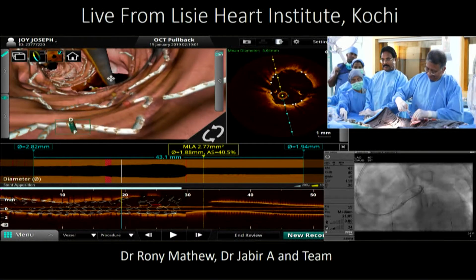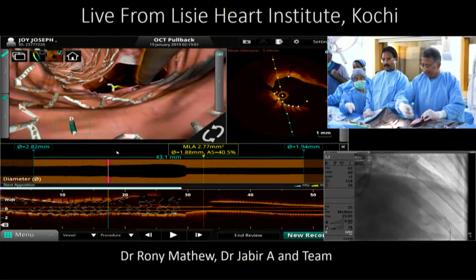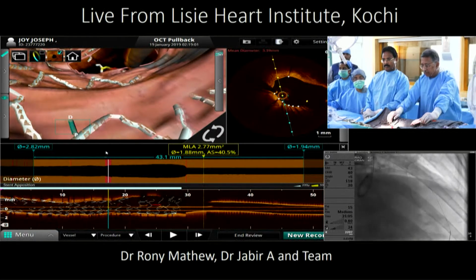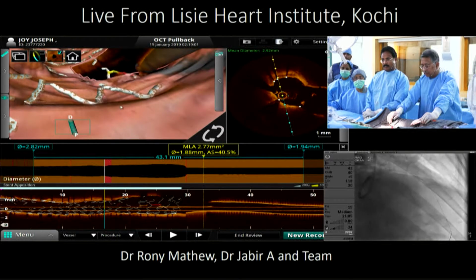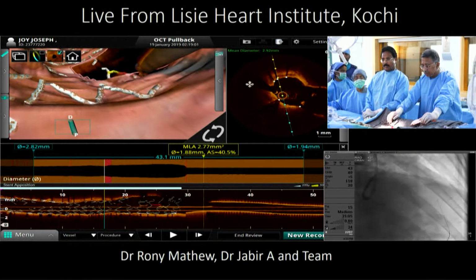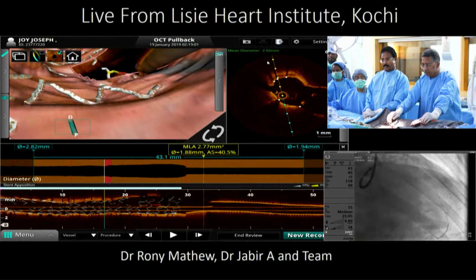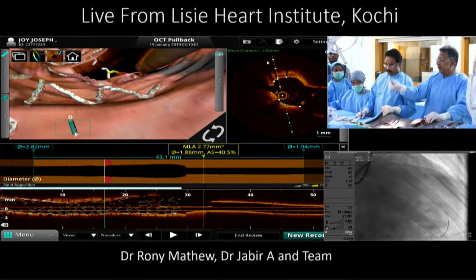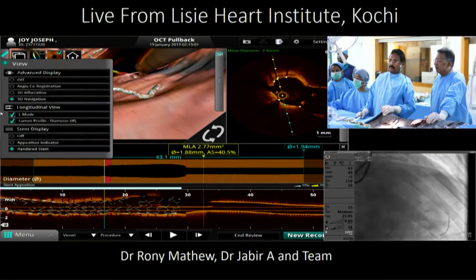What is the incidence of restenosis when you have absolutely no disease at the ostium of the circumflex and it looks very good? I think it's very, very small to start with. So when we are talking about that data, it becomes difficult to justify. This can be done as purely a research project at this point, rather than as clinical practice. We don't have that much data. As far as I know, the largest series I've seen is the one from Dr. Mathew that he presented at EBC. Can we go to the 3D bifurcation view again? Yeah.